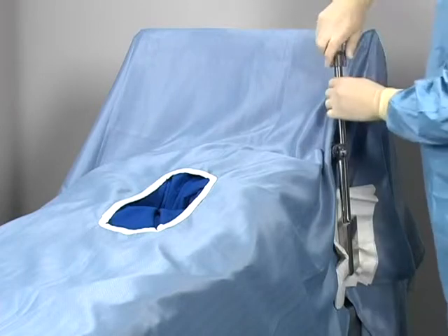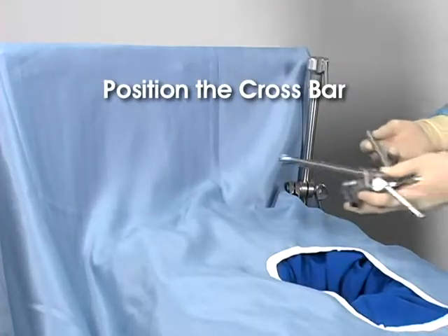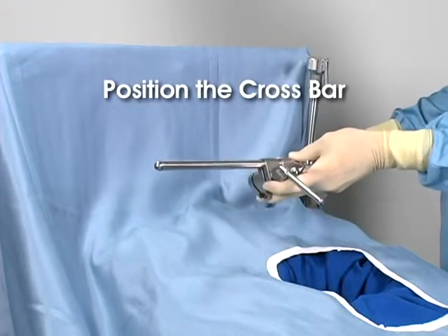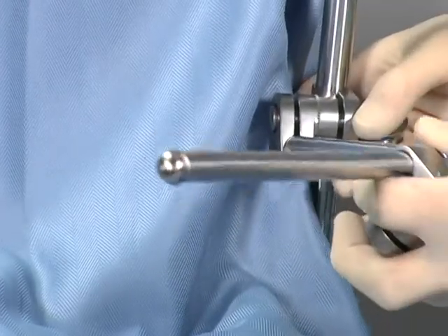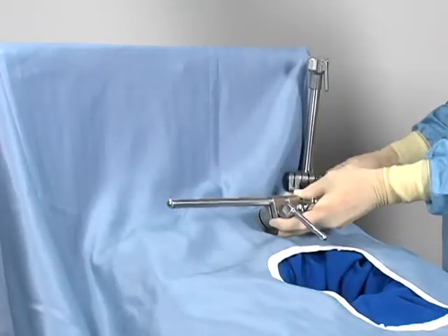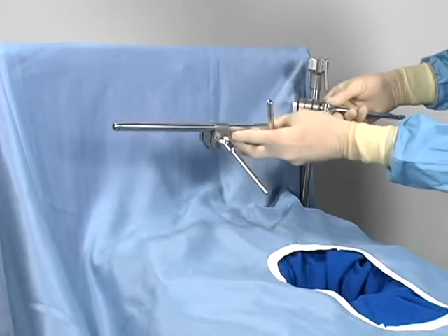Mounting the rail clamp over the drapes ensures protection against any stray current from electrical surgical devices by insulating the rail clamp from the OR table. For upper abdominal procedures, secure the clamp just under the patient's arm. Position the crossbar in the rail clamp and above the patient. Insert the crossbar into the rail clamp's universal joint. For upper abdominal procedures, position the crossbar at the patient's nipple line.